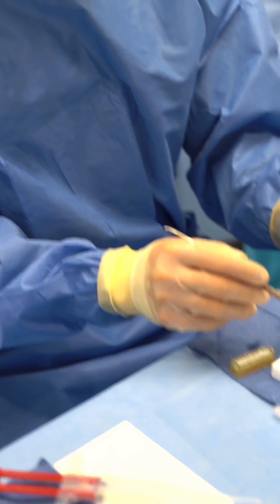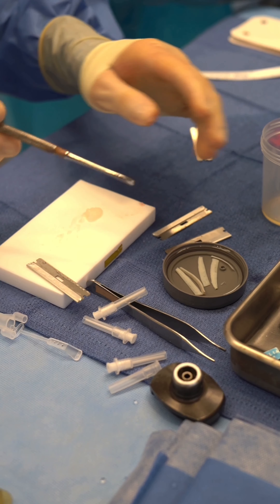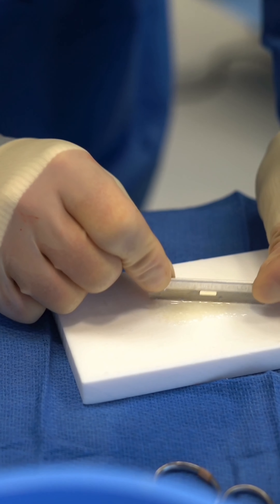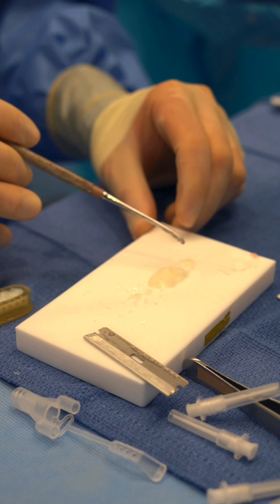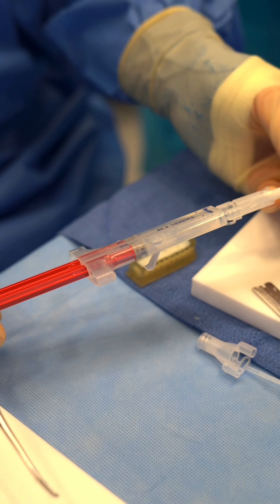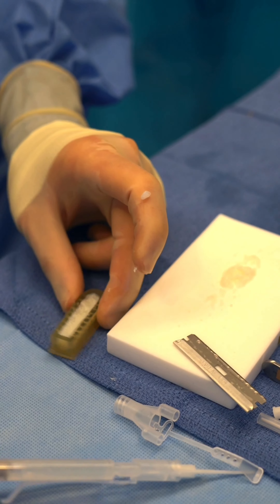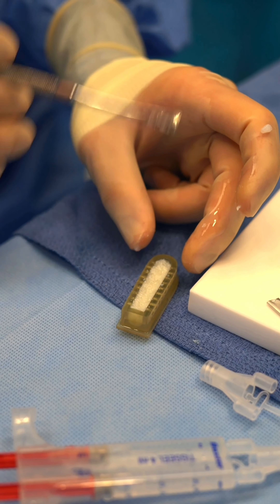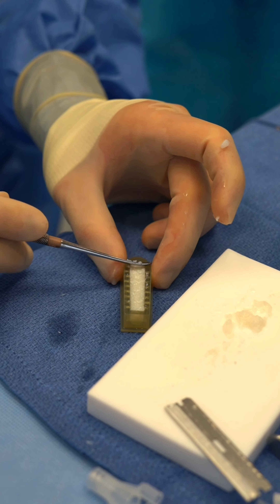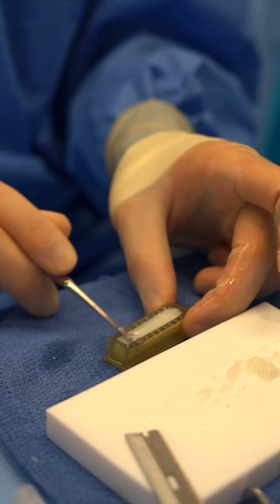We had the cadaver rib — these are some pieces we cut off. These are called rim grafts, so we're going to carve them a little more. The remaining cartilage we diced up is very small, like minced garlic in terms of how fine it is. This allows you to combine it with fibrin glue — a very safe blood product, first documented in the literature in the 1950s. You combine it with the diced cartilage and that's what's happening in this mold. You put the fibrin down with the cartilage and keep building the mold until you have a very nice dorsal onlay graft that can go on top of the nasal dorsum, the bridge.